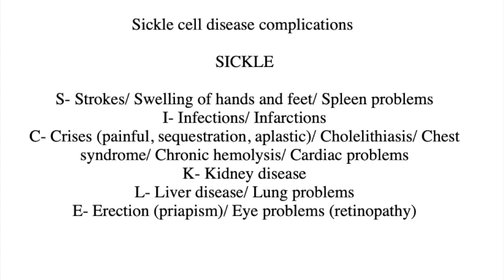For example, in aplastic crisis, there will be a significant drop in the absolute reticulocyte count along with a drop in the hemoglobin, whereas in hemolytic crisis, there will be increased polychromasia, which can be seen on the morphology as increased absolute reticulocyte count, and a systemic sickle cell crisis is characterized by numerous sickle cells in the blood smear.